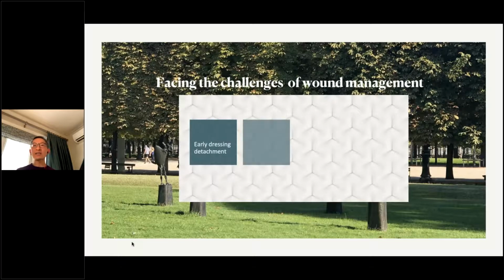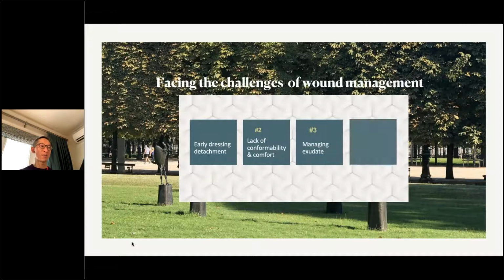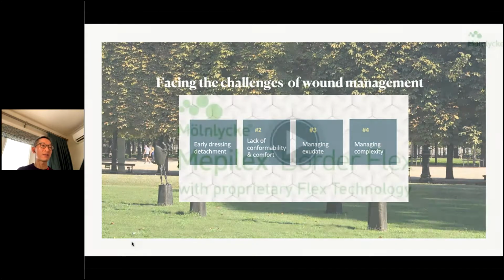So again, some of the biggest challenges of wound management, and very similar to what you have verbalized and voted earlier, are early dressing detachment, lack of conformability and comfort, poor ability to manage or handle wound exudate, and also the whole patient complexity that is part of the holistic care of a patient.